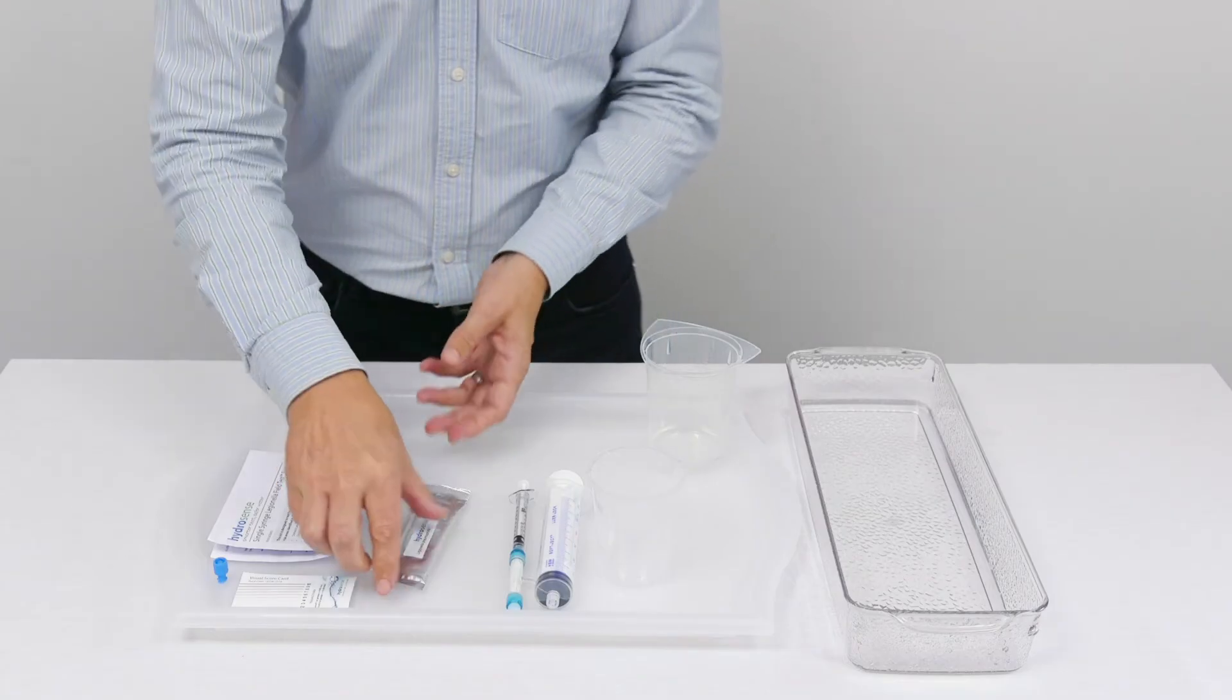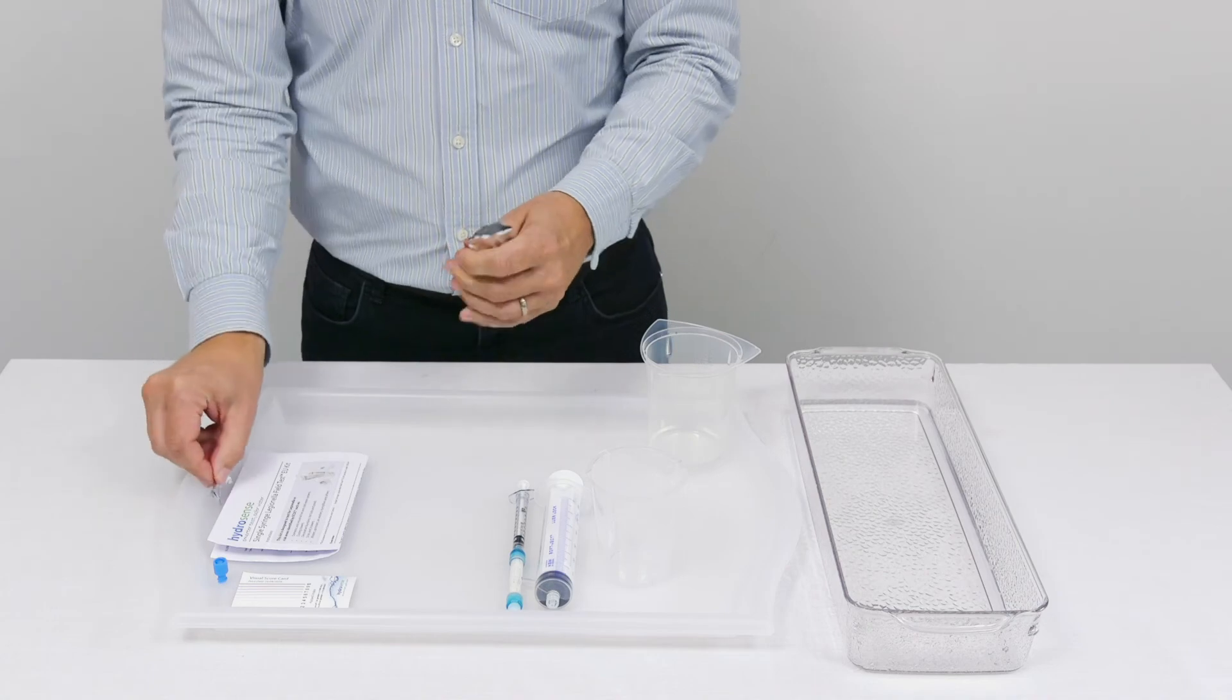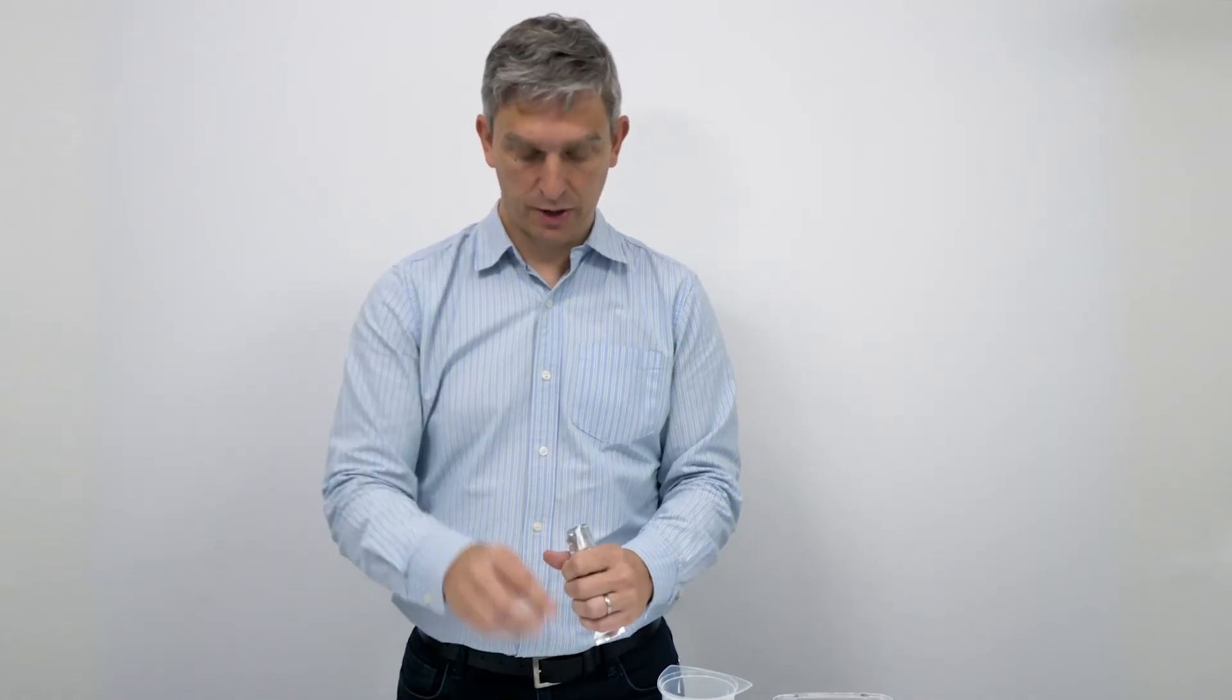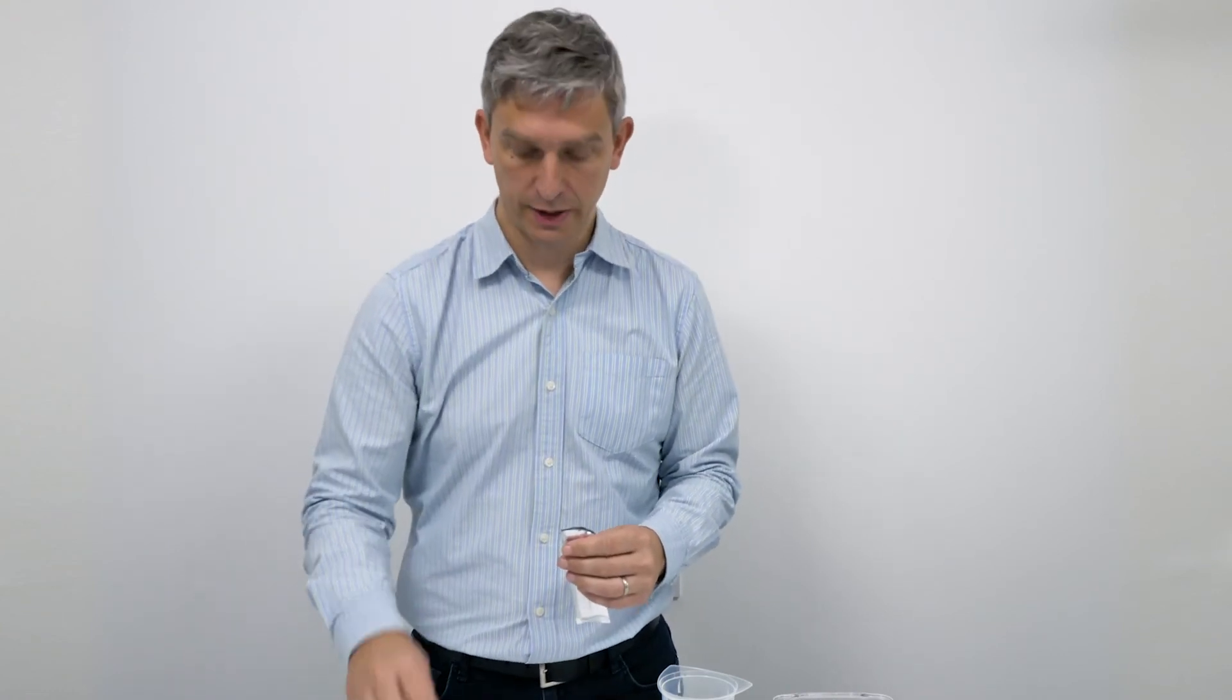Now we've collected our 0.1 mil sample, we can then take the test from its foil pouch. We do this just prior to running the test. The test is sensitive to moisture and it's recommended that you only remove it just prior to running the test.